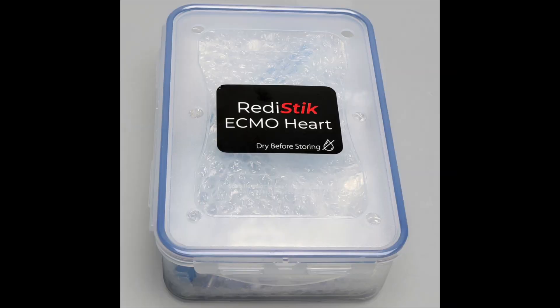The heart comes with a protective case. We recommend draining the heart, drying it, and storing it in the case in between simulations.